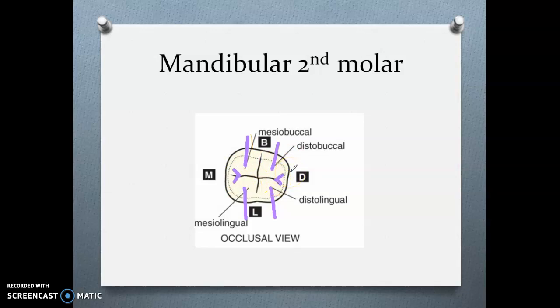You have to remember, when working on the tooth, you always start the tooth prep on the pit area. So either you start on the mesial pit area or the distal pit or the central pit. Okay. So what burr are you going to use? According to Sturdivant's Art and Science of Operative Dentistry, you use a short pear-shaped burr. It's either a 329 or 330 burr.